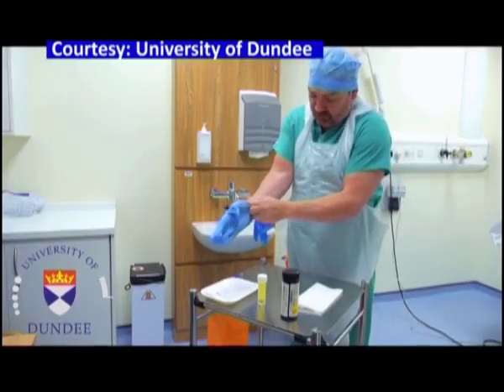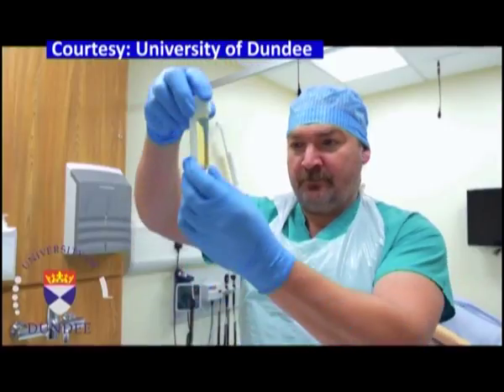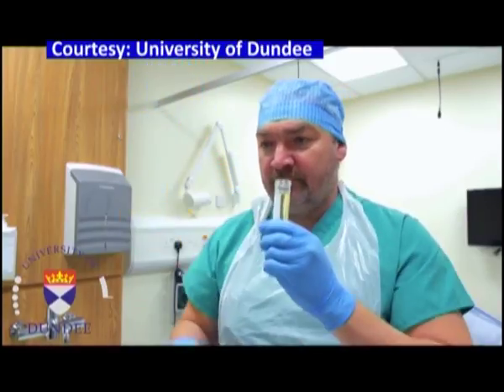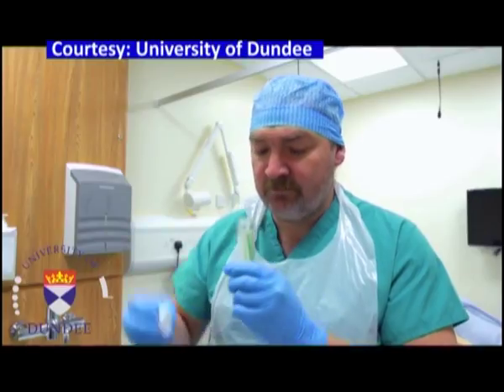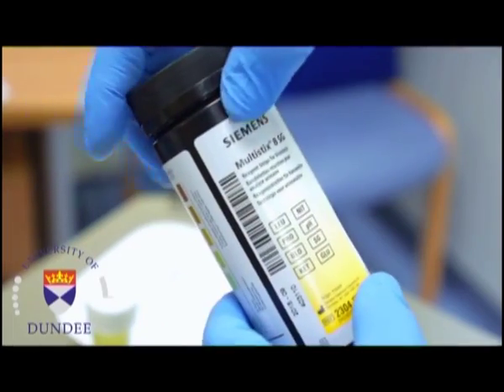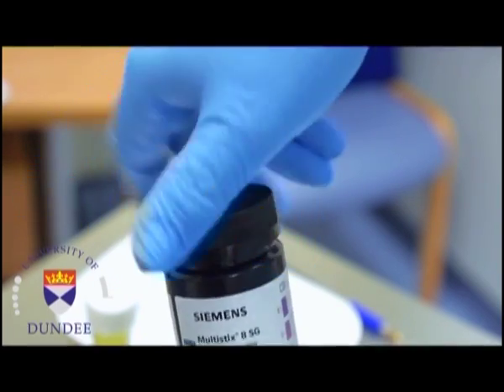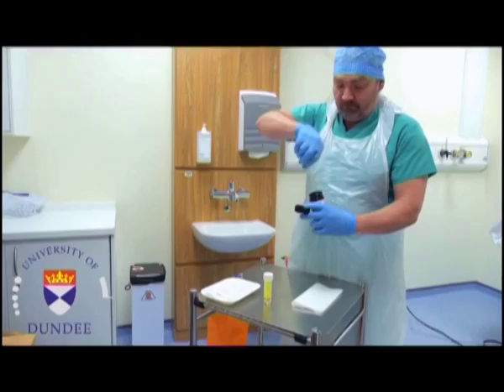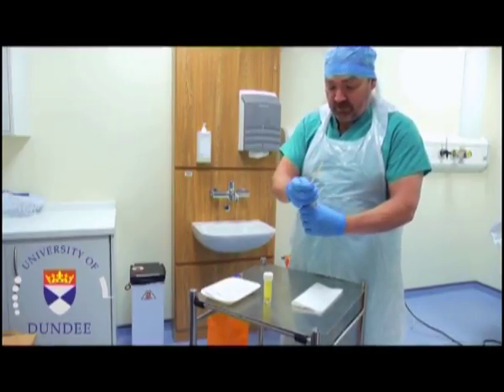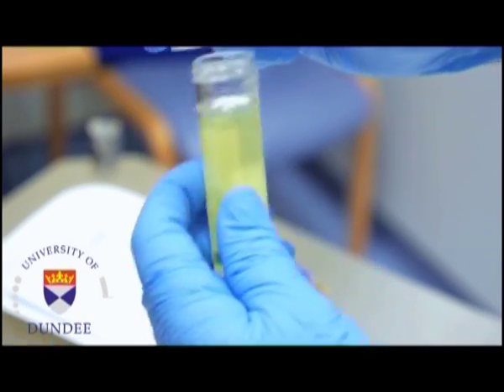Now, the visual examination. During the visual examination of the urine, the laboratorian observes the urine's color and clarity. These can be signs of what substances may be present in the urine. They are interpreted in conjunction with results obtained during the chemical and microscopic examinations to confirm what substances are present. Urine test results should always be interpreted using the reference range provided by the laboratory that performed the test or using information provided by the test strip or device manufacturer.